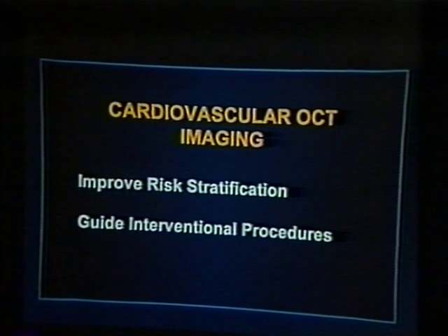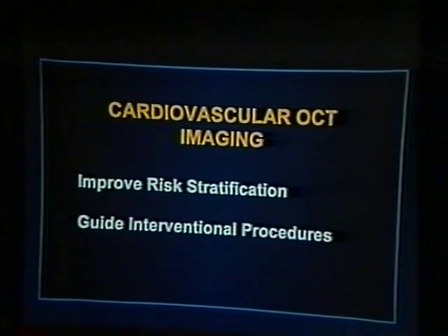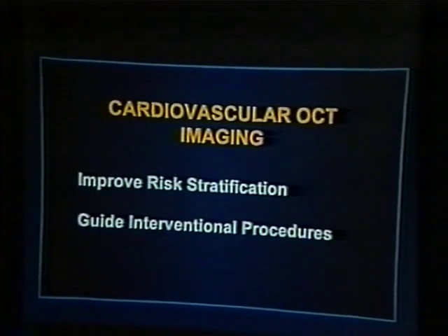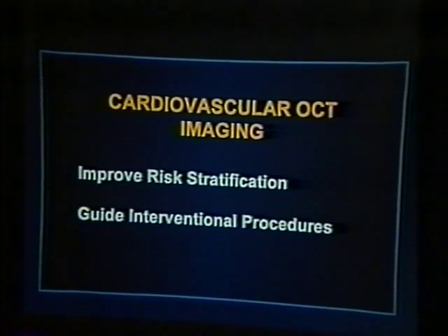OCT was originally developed by my partners Eric Swanson and James Fujimoto to image the transparent tissue of the eye at unprecedented resolutions. Humphrey Instruments has subsequently commercialized the device, where it's being used in a wide range of retinal macular diseases.